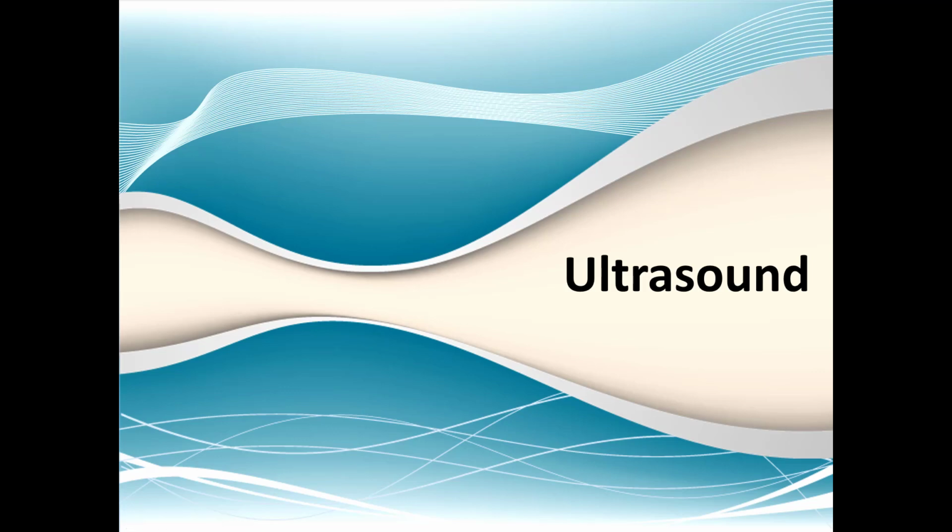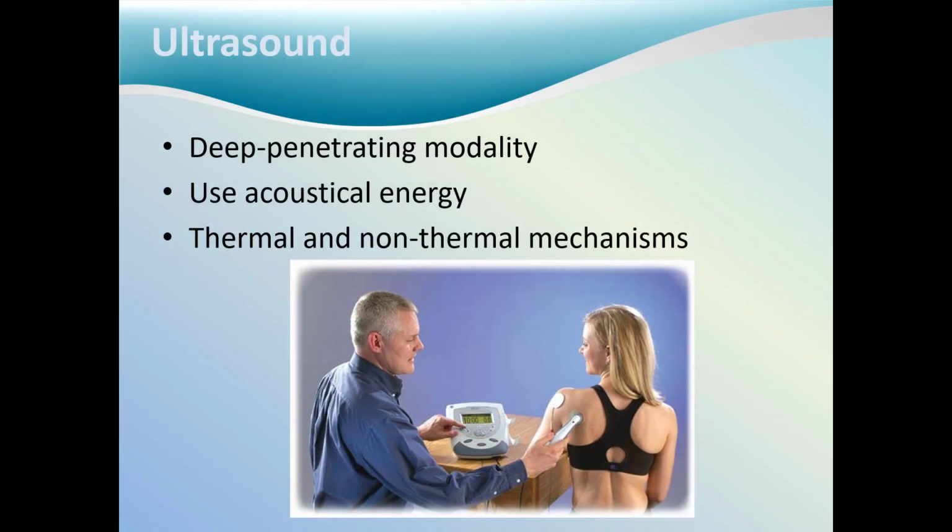Therapeutic ultrasound. Therapeutic ultrasound is one of the most misused modalities among clinicians. It is very important that you understand the theory, principles, and applications for the use of ultrasound as a modality. Ultrasound can be very effective if used properly.